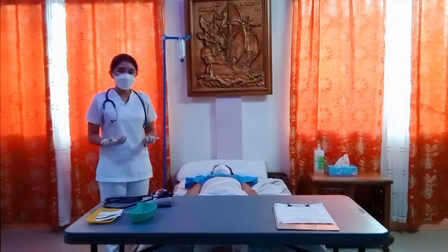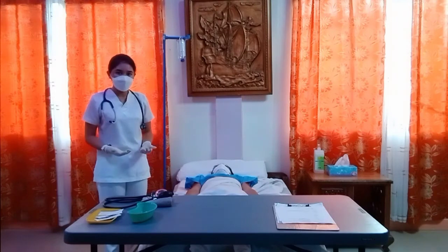Next is to place the client in an appropriate sitting position.